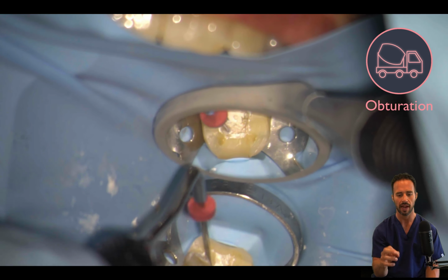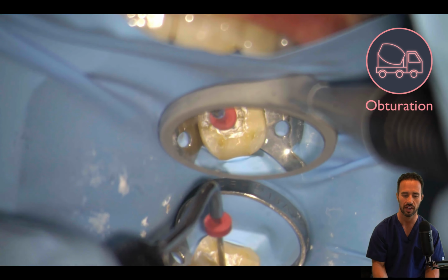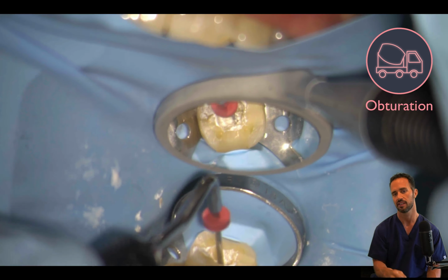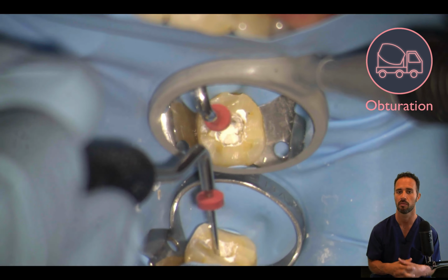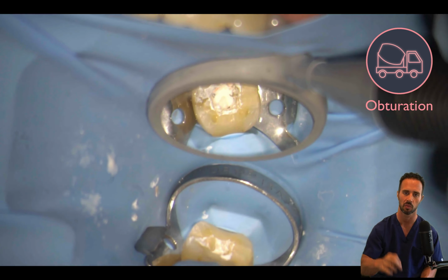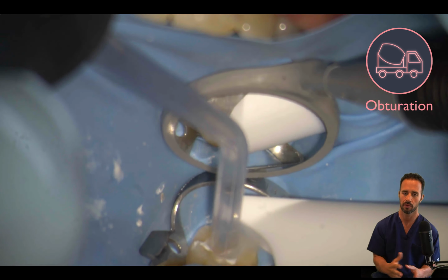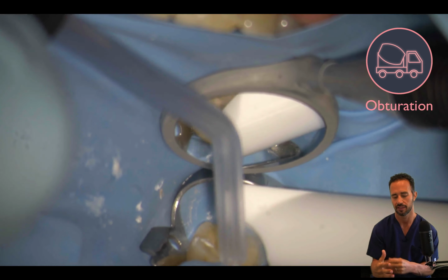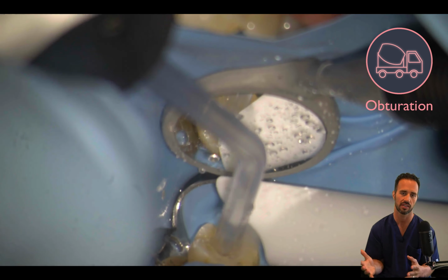And so now we're compacting our gutta-percha with our Buchanan plugger. This is the size 1, which is the red color, and it's the larger of the two sides. Remember, that's what I reach for the majority of the time. The big side of the red Buchanan plugger. And there you have it. We're going to make our fine finishing touches on our root fillings here, but our obturation is essentially finished.